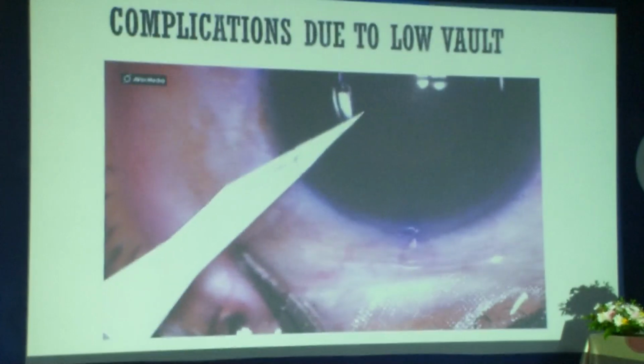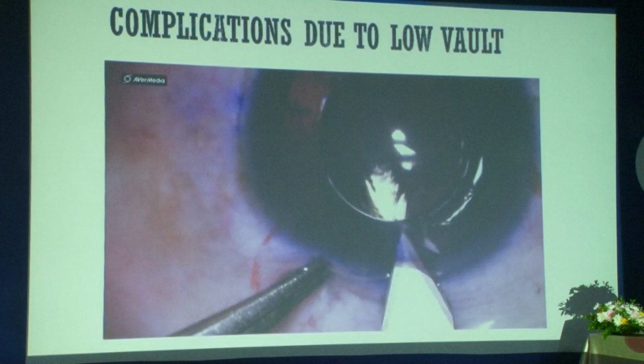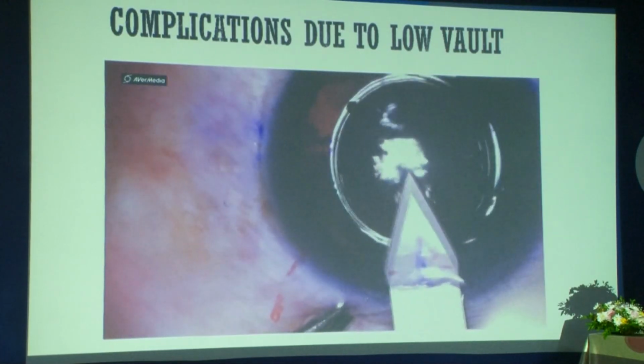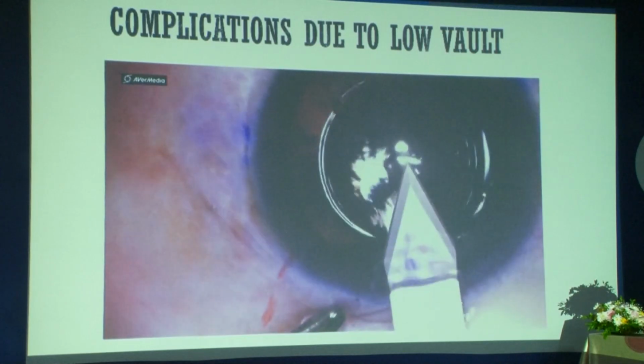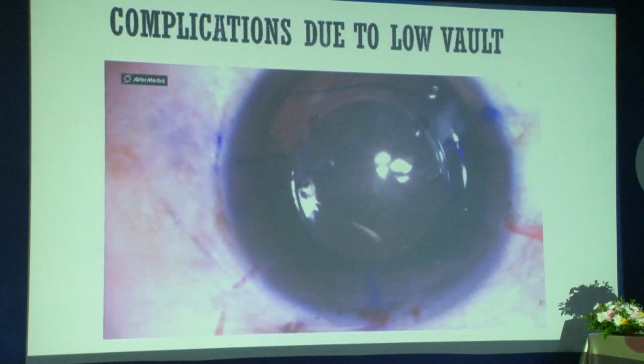Explanting an ICL or an IPCL is actually much easier than it even looks, because this material is very, very pliable and almost never forms any adhesion. So you can rest assured and go in and take it out from the sulcus. It's not like your usual IOL explantation.